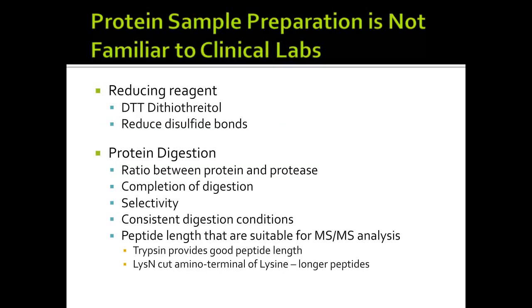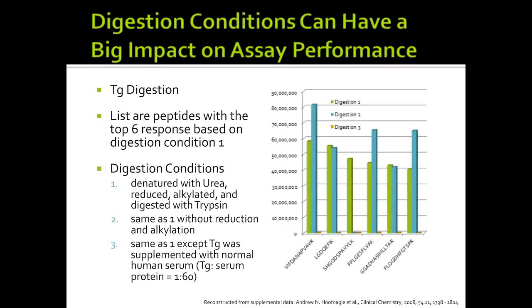So those are a few things, a different way to talk about the workflow: the reducing reagents or protein digestion, to use a couple examples. People have to learn this technology to actually apply it to the mass spec. Even for people who are familiar with proteins, the majority of them is protein discovery or protein omics. With a clinical assay, there's still some gap, and people need to narrow that gap to put an assay that's clinical grade. So those are actually different layers of challenges.